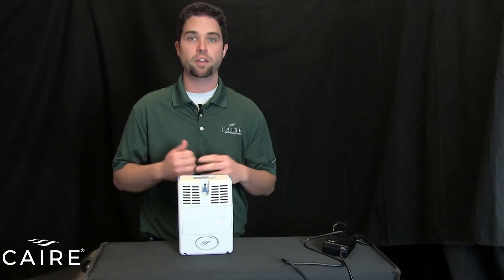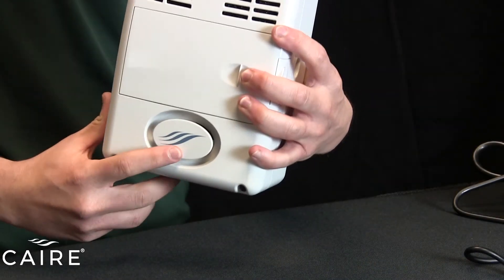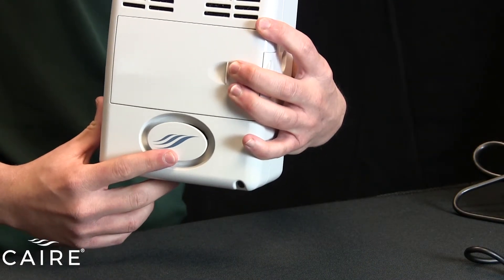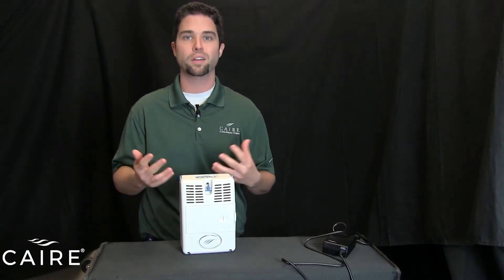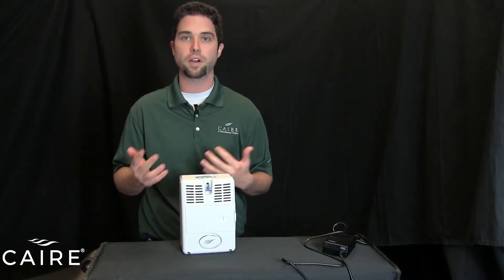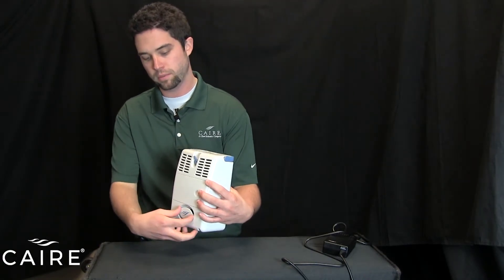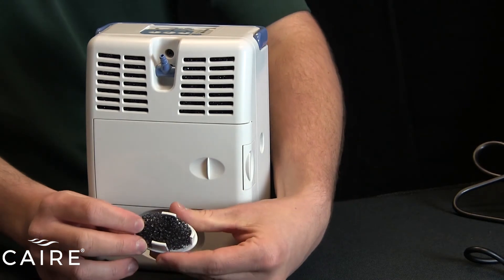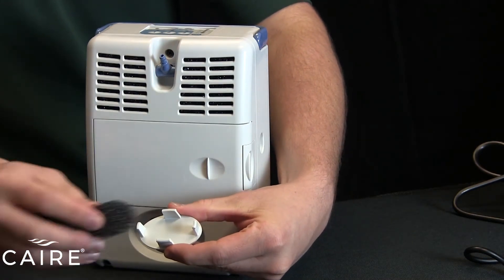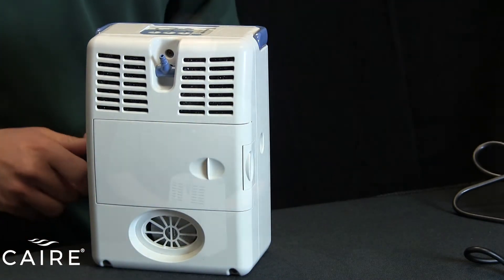Your routine maintenance on the Freestyle is minimal. The air enters the device through the bottom of the unit through a filter in this door. This filter you're going to have to clean once a week — that's our recommendation. What you do is remove it from the device, run it under some warm water with some soap to clean it, then let it dry and put it back inside the unit. Very simple, very easy maintenance. To remove it, the filter door pulls out. You can see the filter inside. Remove the filter, wash it, place it back in after it's dry, and then reinstall it inside the device.